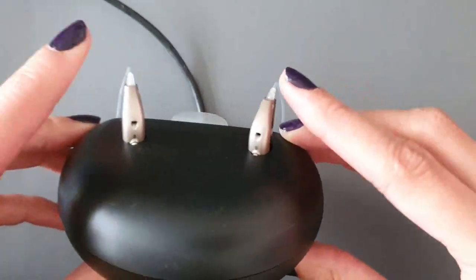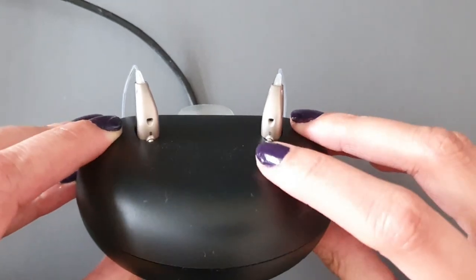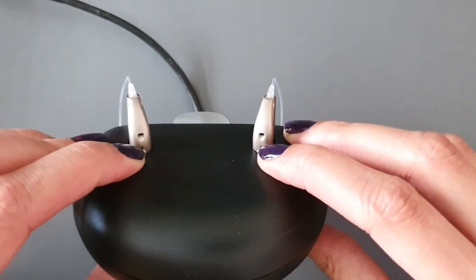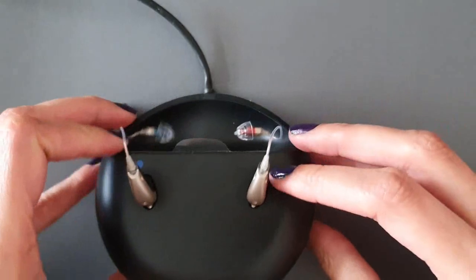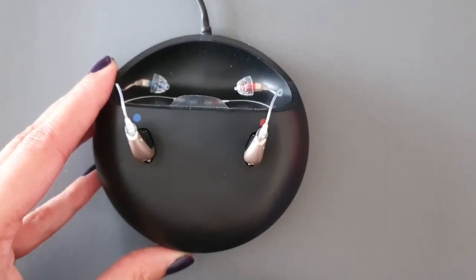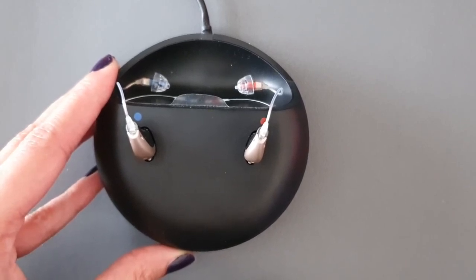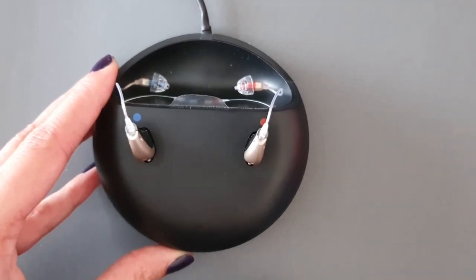When you dock them in, make sure you've pushed the hearing aids all the way in and the LED light on the hearing aids will start flashing. The hearing aids take up to around three hours to get a full charge. The LED light will turn red when the hearing aid is charging, and then turn green when it's fully charged.